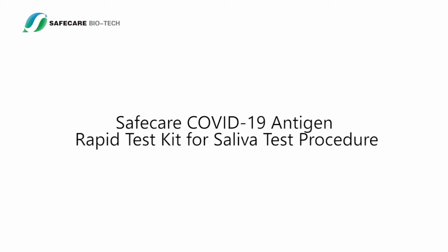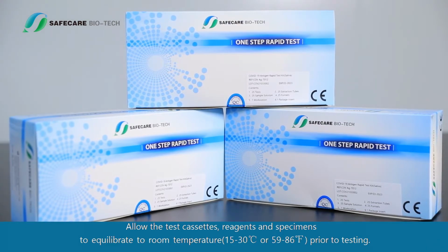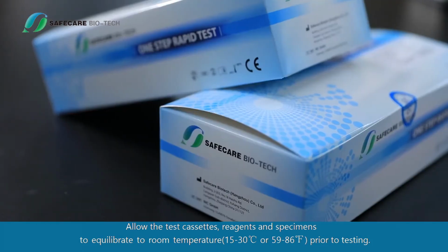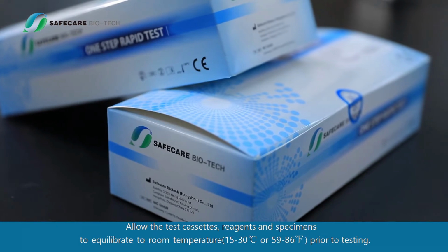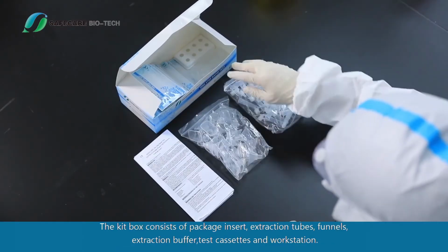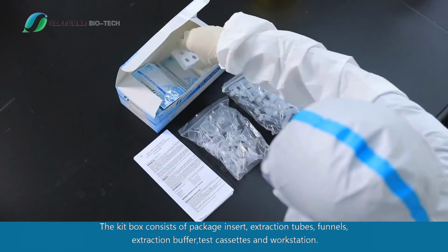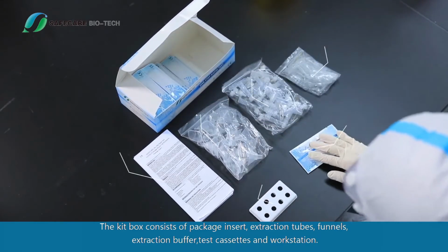Safecare COVID-19 Antigen Rapid Test Kit for Saliva Test Procedure. Allow the test cassettes, reagents and specimens to equilibrate to room temperature, 15 to 30 degrees Celsius or 59 to 86 degrees Fahrenheit, prior to testing. For best results, the test should be performed in 1 hour. The kit box consists of package insert, extraction tubes, funnels, extraction buffer, test cassettes and workstation.